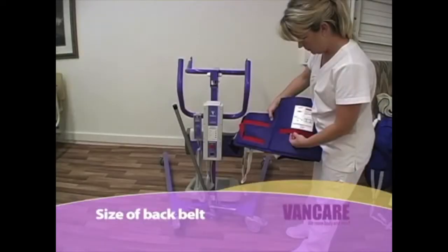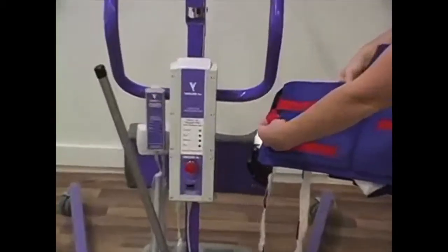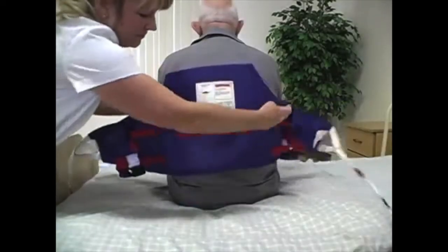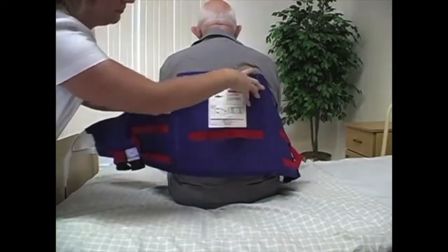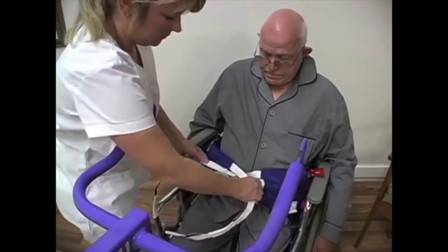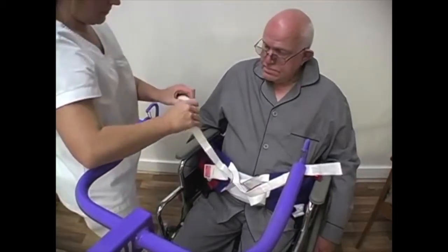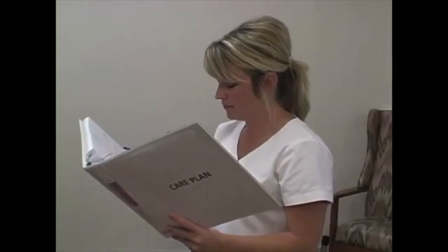Size of back belt. Verilift back belts come in medium and large lengths and in different widths. When transferring a client using a back belt, the back belt should be wide enough to fit from the top of the gluteal fold to 2 to 3 inches below the lower edge of the client's shoulder blades. When using the crossed strap method of transfer, the back belt should be long enough for the belt fabric to fit around the client's abdomen with sling fabric touching the client. When the correct size back belt has been determined, the information should be documented in the client care plan and communicated to the nursing staff.